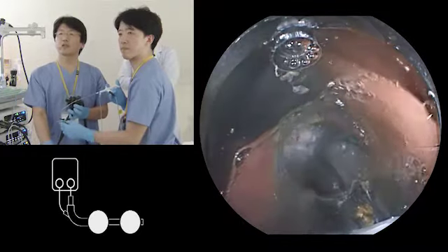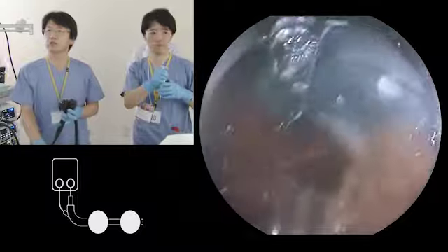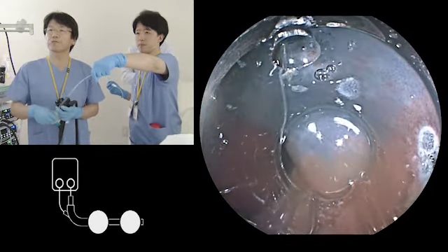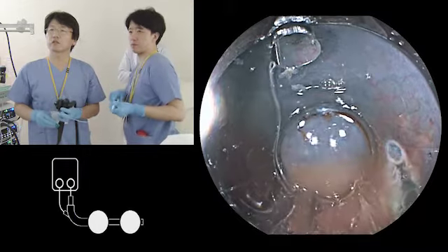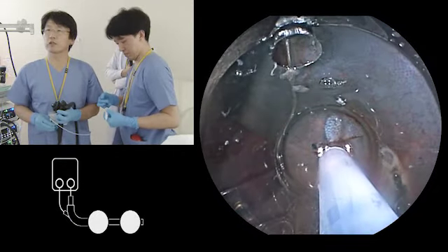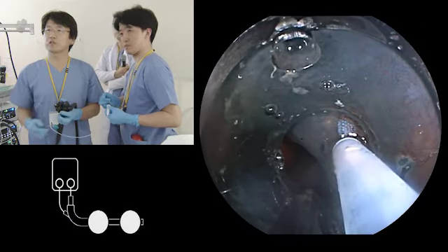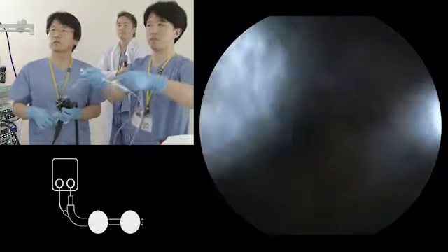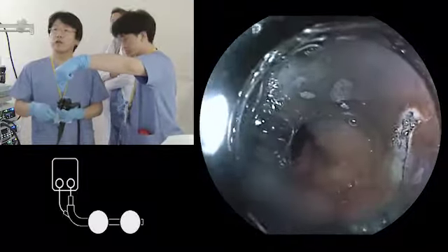Even with this short length of mucosa, I can show you, as long as the intact mucosa remains, you can add injection and you can make a very good situation, like the initiation of the ESD. Okay, so the needle out. So the mucosa is intact, so inject. You can make a maximum elevation, even at the end stage of the procedure. Okay, stop. Like this. Then you can cut the mucosa safely and dissect it.